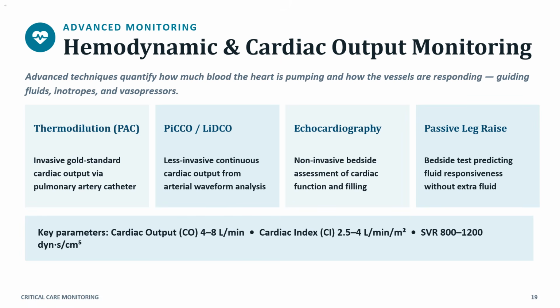Thermodilution (PAC): invasive gold standard cardiac output via pulmonary artery catheter. This provides direct measurements but is invasive and reserved for complex cases where detailed data is needed. LiDCO: less invasive continuous cardiac output from arterial waveform analysis. This gives beat-to-beat output with less risk than a pulmonary artery catheter.